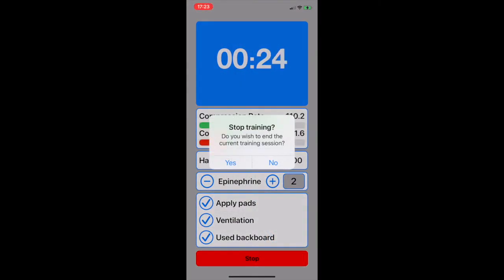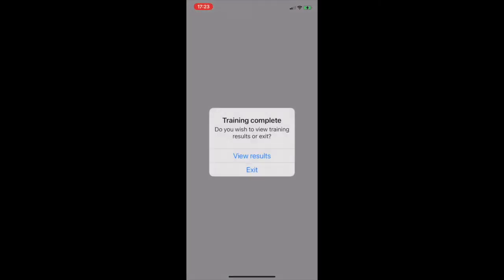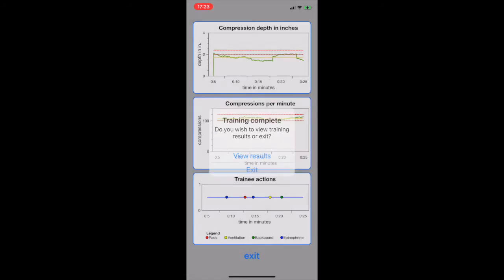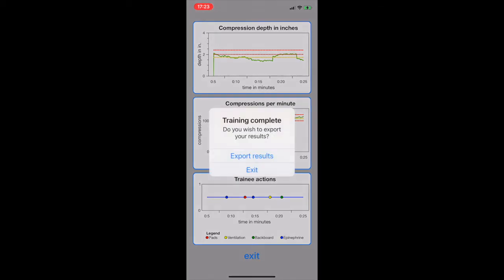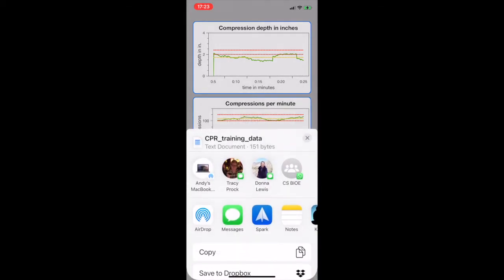Once the training is completed, we've provided a method for viewing the overall results, as well as exporting them if desired using Apple's Share Sheet. This will allow the resulting CSV file to be shared via email, saved to file, shared via Bluetooth, or whatever method happens to be most readily available.